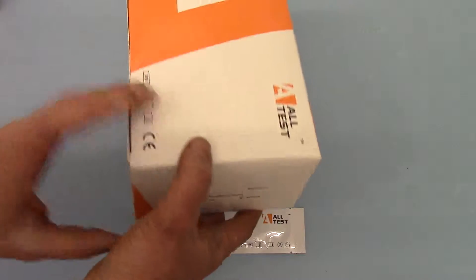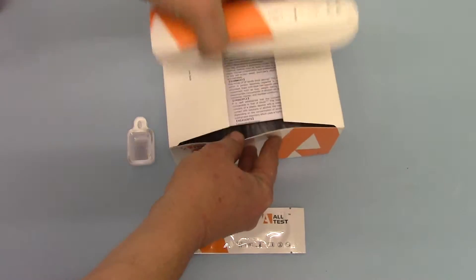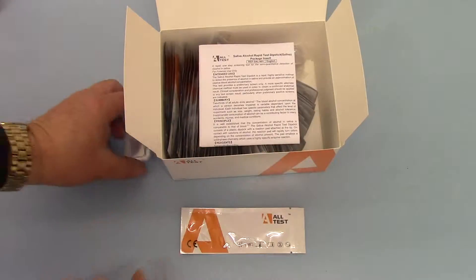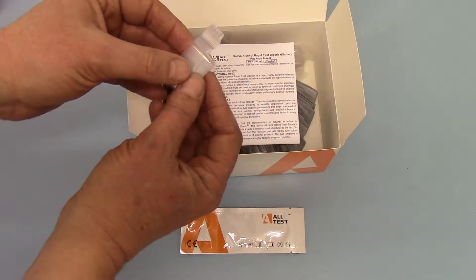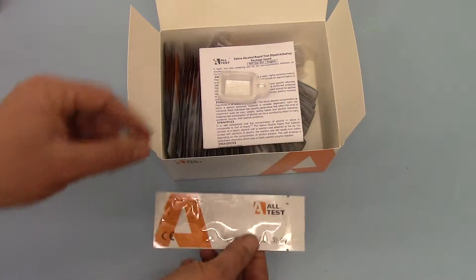The pack contents is 50 pieces. If we just clip open this, you'll see what you get inside a pack: a data sheet, 50 of these little saliva collectors which are very easy to use, and 50 individually foil-wrapped alcohol test strips.